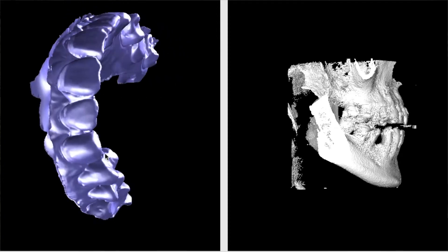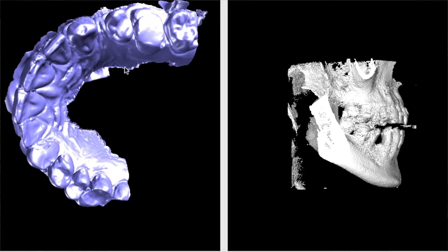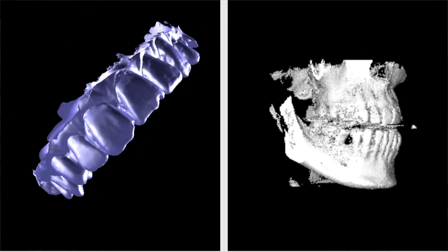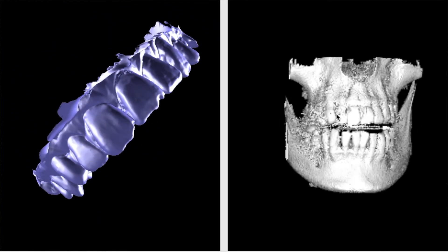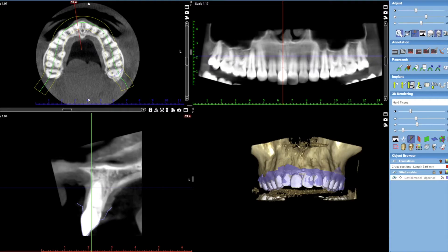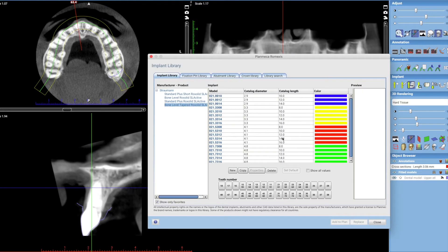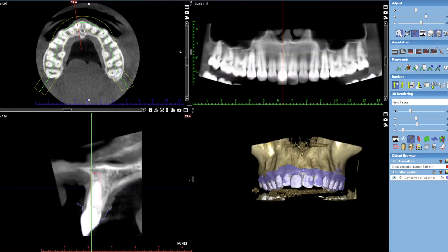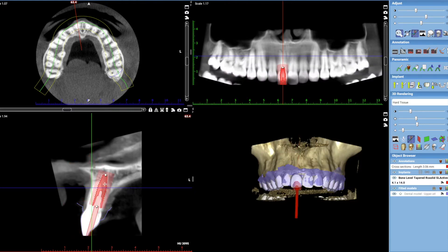We have a CBCT scan of your jaw along with an intraoral scan of your teeth, and we've superimposed those models — those data sets — together, which we covered in our last episode. Using these two bits of data, we can now plan your implant position.